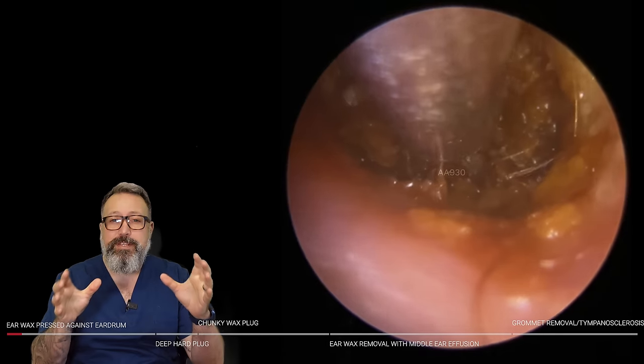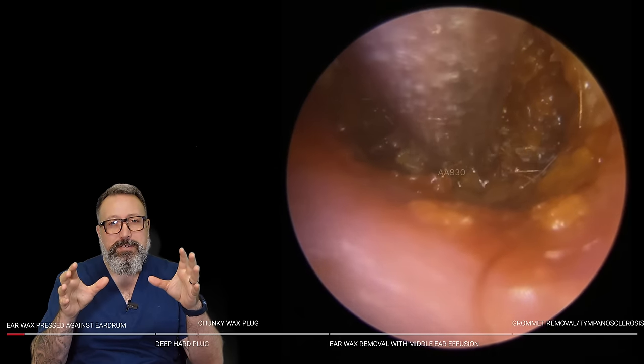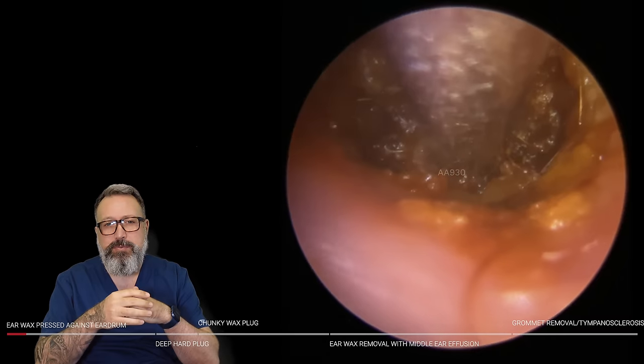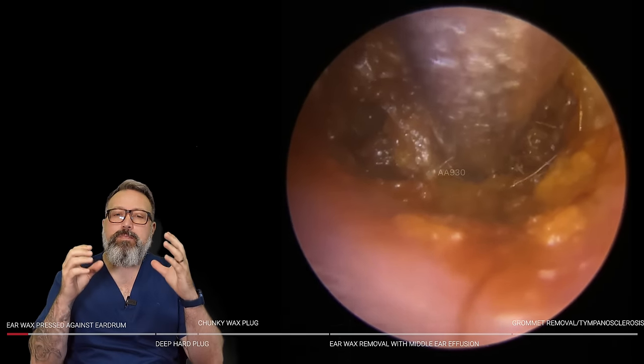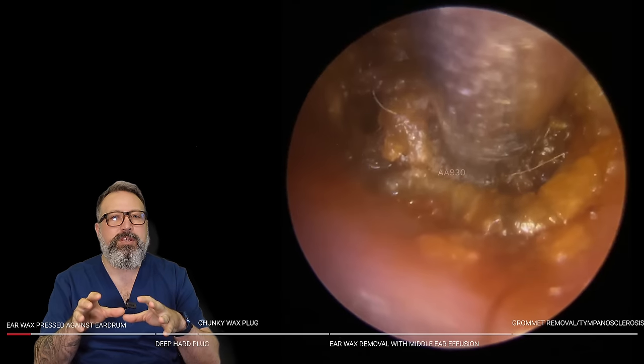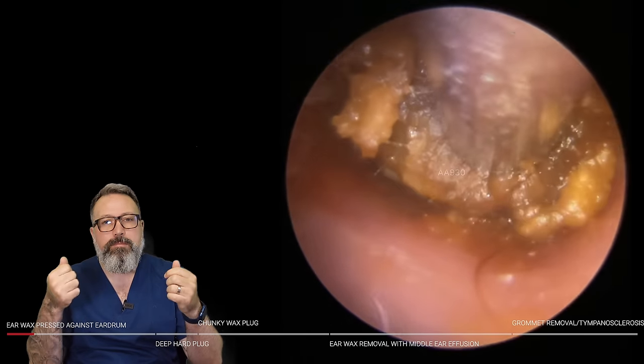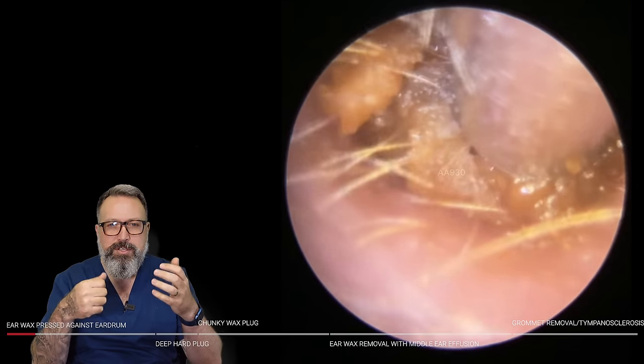In this particular ear canal we've got a very, very deep piece of wax sitting right on top of the eardrum. It's really compressed down in that area — right down in the osseous portion of the ear canal. It's been pushed down there, probably by a patient using cotton buds or Q-tips.